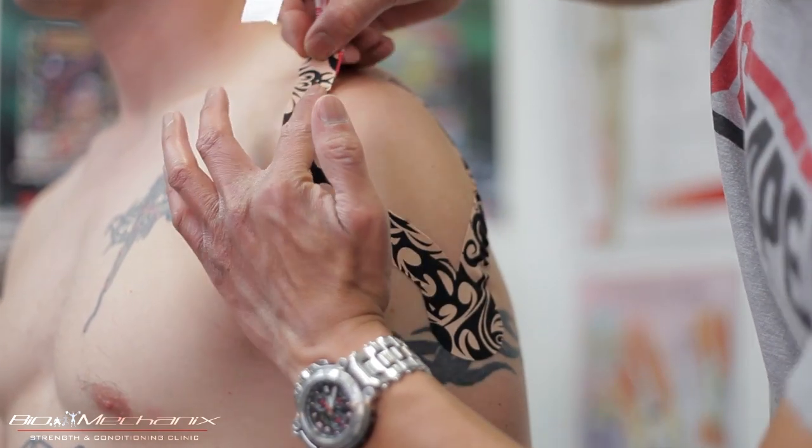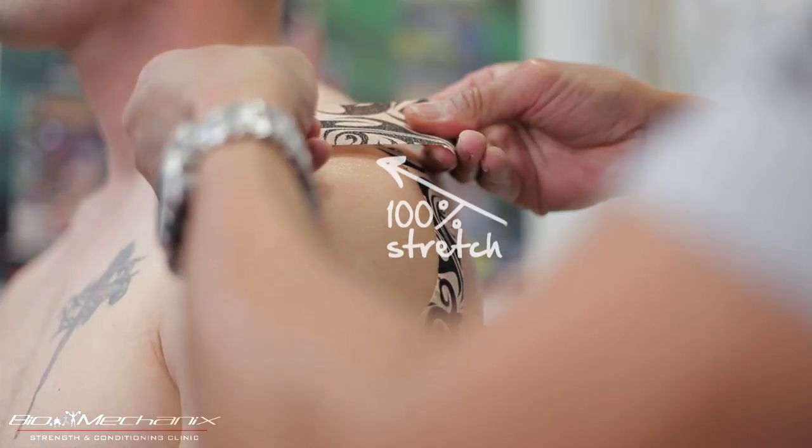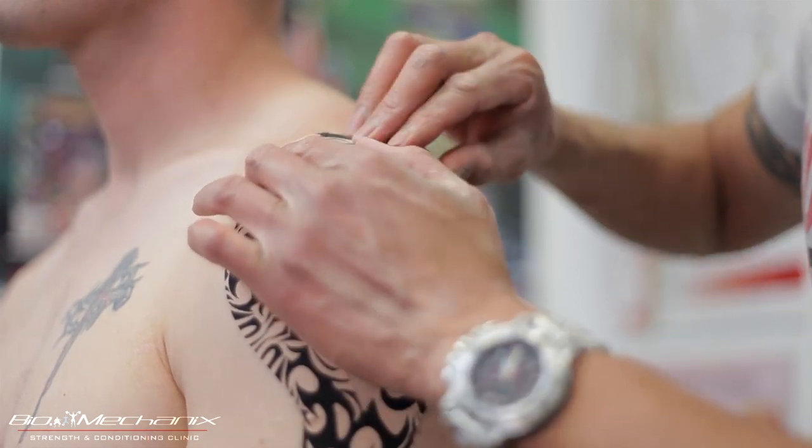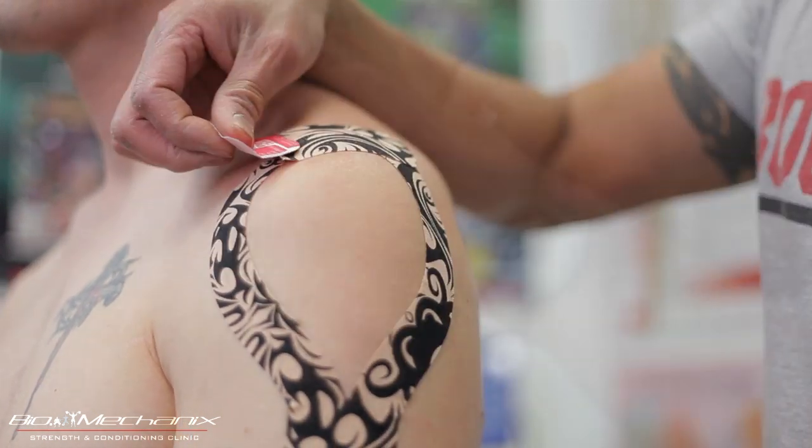Since Luke here has an AC impingement syndrome, I'm going to apply a decompression tape immediately on top of his AC joint. I'm going to use a band-aid method and use a hundred percent stretch.